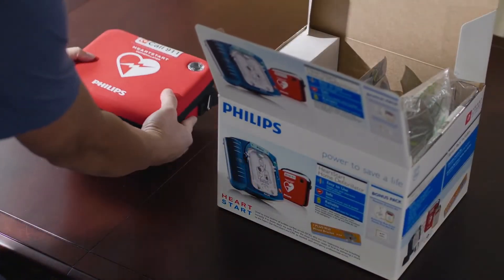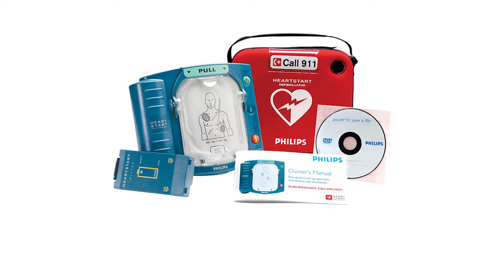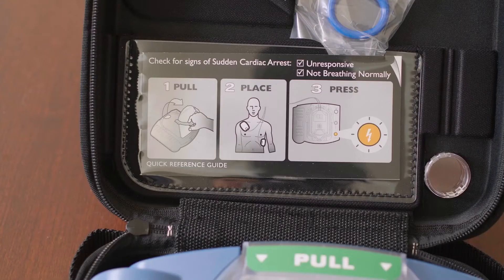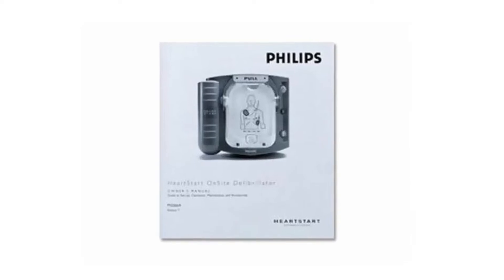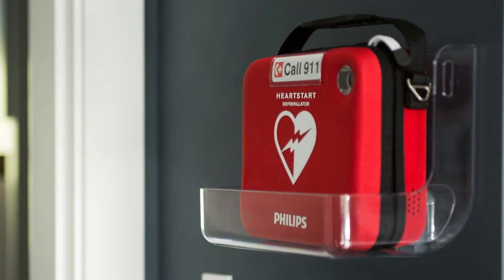Your HeartStart Home AED comes with a short training video that you should watch and review once a year. Review the quick reference guide that came with the device, as it contains additional information for users who are hearing impaired. Keep the quick reference guide and the owner's manual in the carry case with the device. On the back of the carrying case there is a call 911 card — on the back of that card, write your name and address.